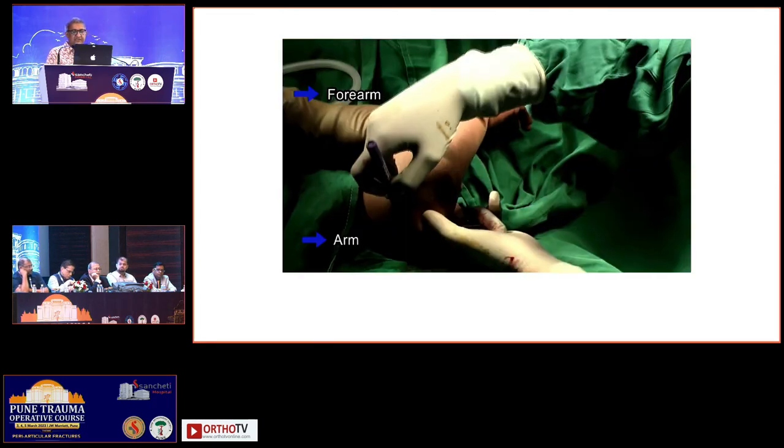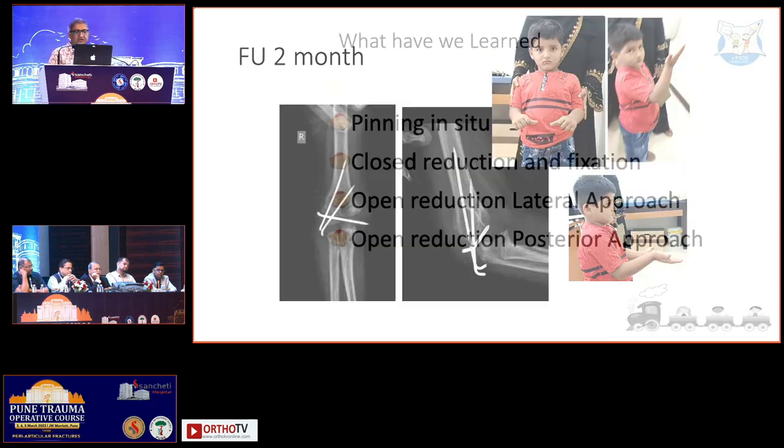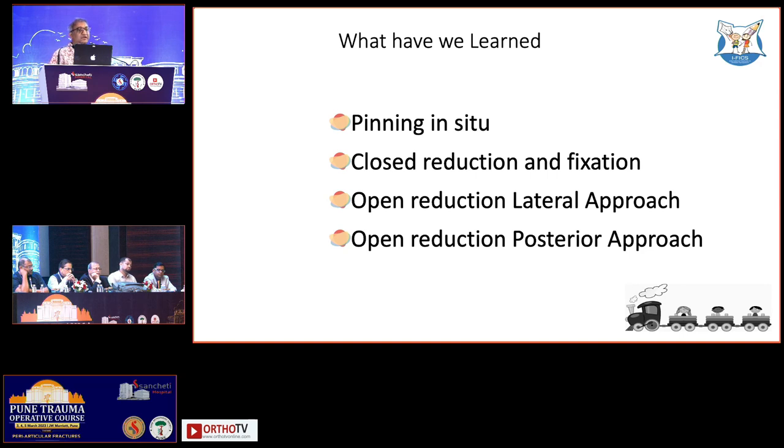Immobilized for 3 weeks, we started mobilizing once the fracture became gummy, and the wires were removed at 2 months. So now we've learned these four procedures: pinning in situ, open reduction with lateral approach, which I have shown you, and we have also shown you open reduction with posterior approach. So it's been a good session.